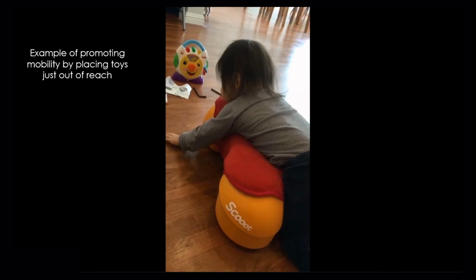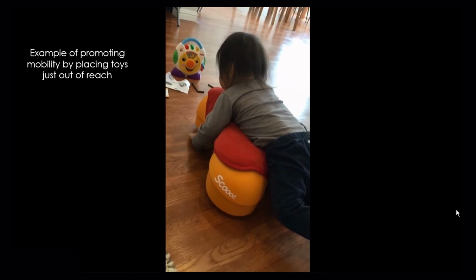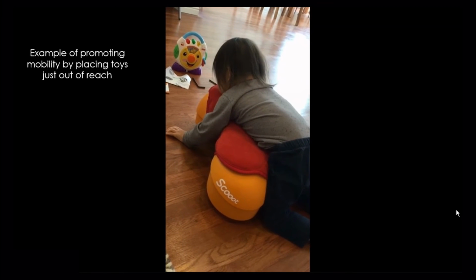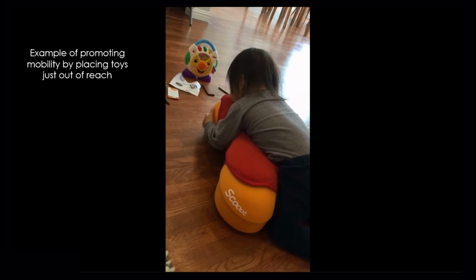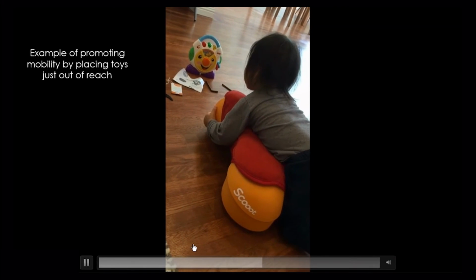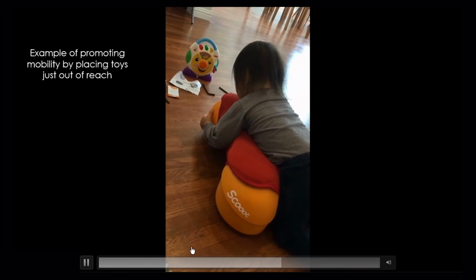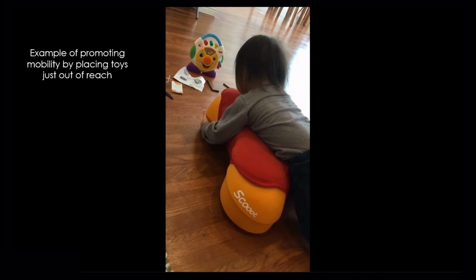Just seeing Jane in this position, Natalie, one of the pieces of advice that we've got from a therapist that we do a lot of work with is that just under the chin, it's possible to tuck a small roll or something similar underneath the cushion so that you have a little bit of elevation. The child can almost rest their chin. So it's useful if they have poor head control or if they have breathing problems. Yeah, that would be a good idea. Use a little towel roll too and tape it down there.